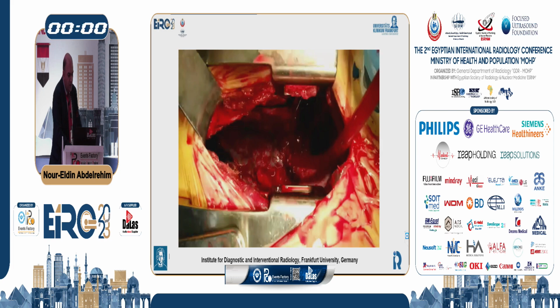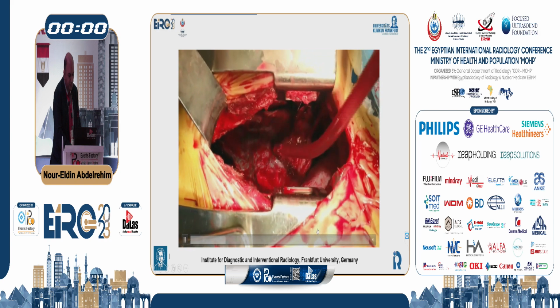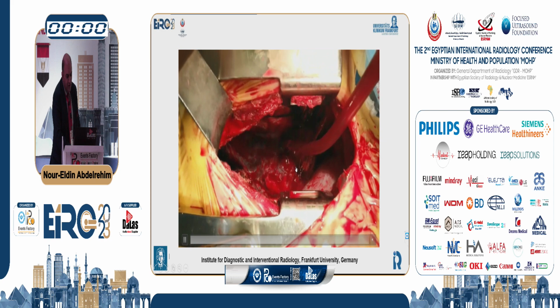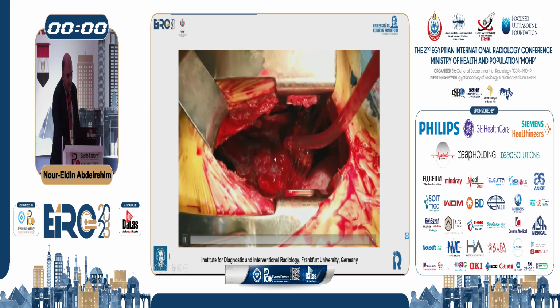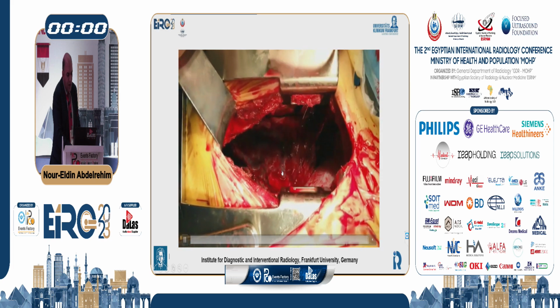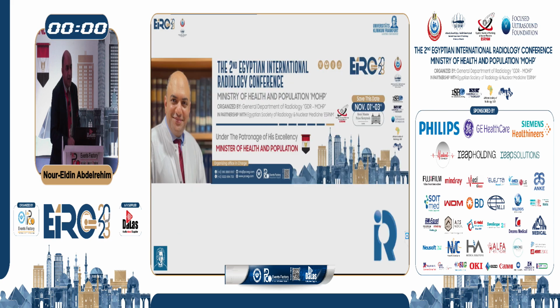This is after biopsy from a lesion which was a fungus, and you can see the bleeding coming from the biopsy tract. The patient was bleeding, and we were obliged to transfer the patient directly to thoracic surgery. So I hope that I covered all the tricks and tips for such a case regarding lung biopsy. Thank you for your attention.